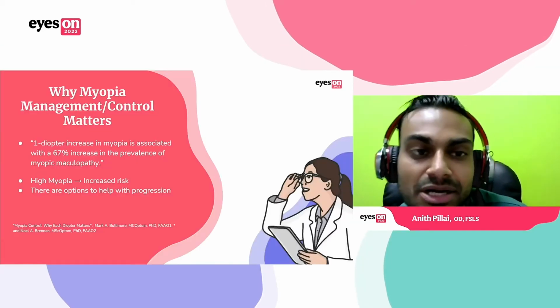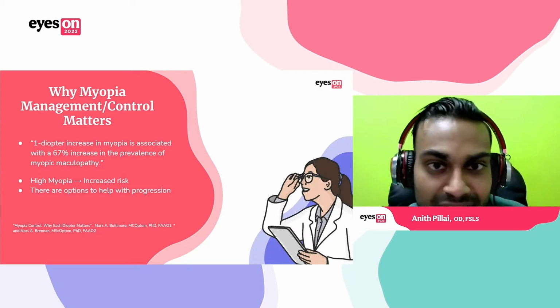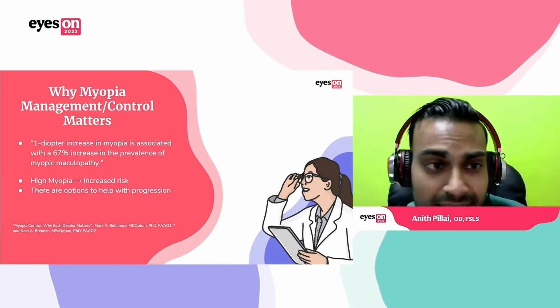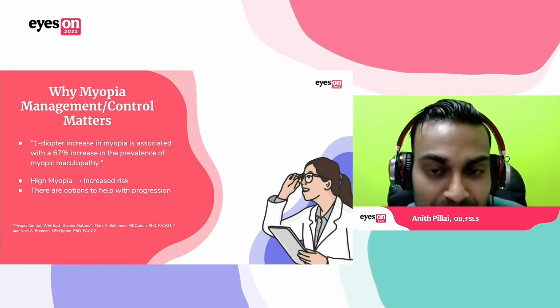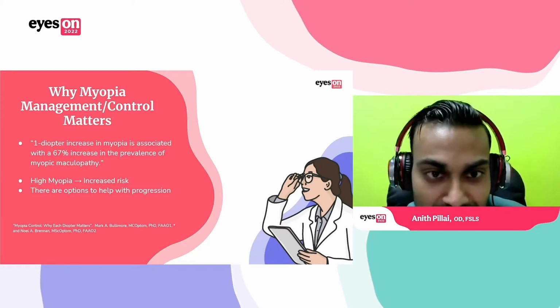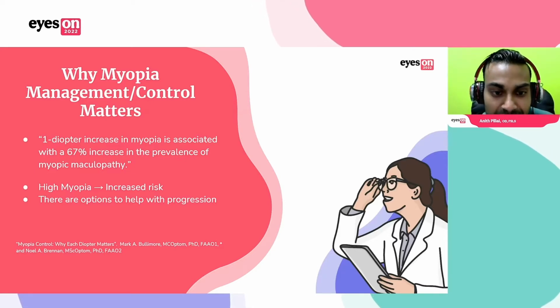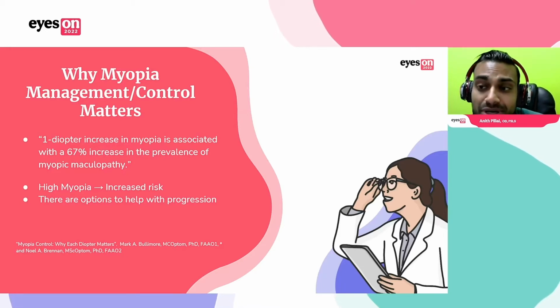And I'm not going to talk too much about why we should do ortho-K, why myopia management or myopia control matters. But I will just address this one slide. It shows that the higher the myopia, the more myopic progression a child has, the more likely of retinal issues later on in life. There's something we can do besides just doing glasses and regular contact lenses. There is intervention we can do to help slow this progression down, and I hope everyone that's joining this session realizes the importance of it.